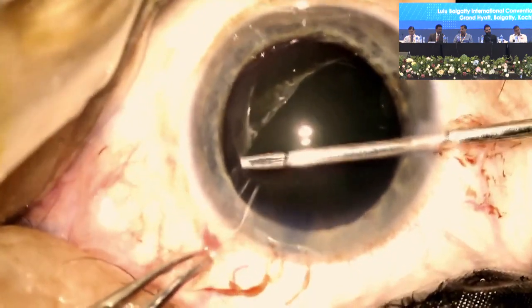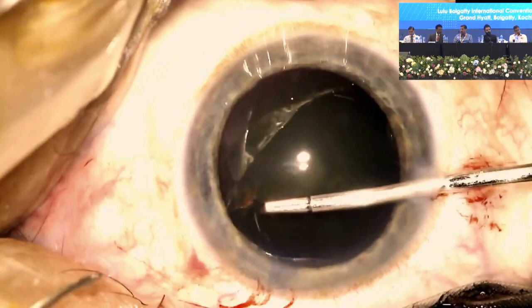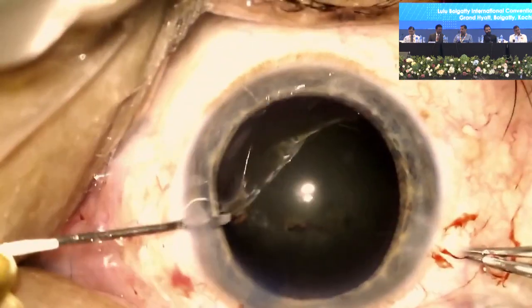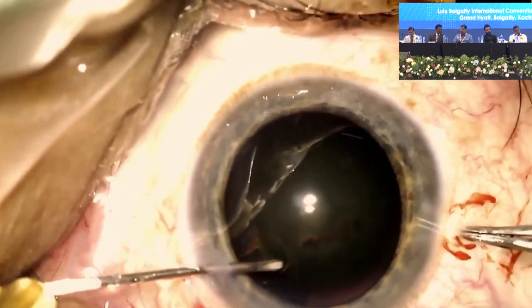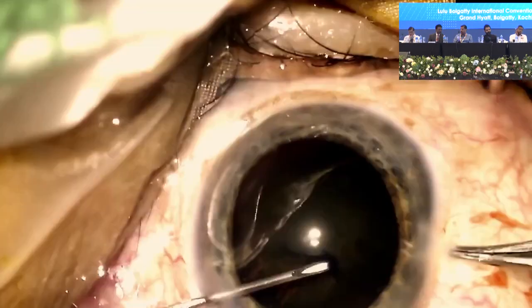Thereafter, I hold it with a utrata forceps and pull on the anterior capsule to create what looks like a tear. I then re-enter from the left side and push this tear and propagate it further. Holding on to the bent capsule and pushing ahead, I'm able to, in this manner, complete the rhexis.